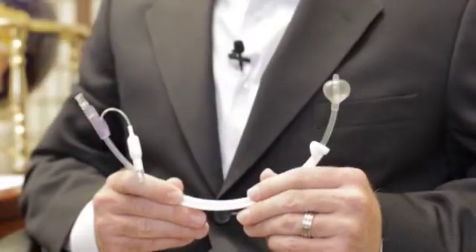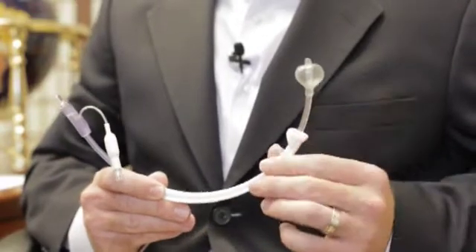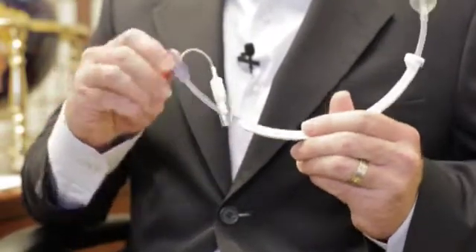If you use the Zenani or Zumi uterine manipulator, we made these same great improvements. We still have the pear-shaped balloon, a shorter, smoother distal tip, and this great flexible connector on the back.